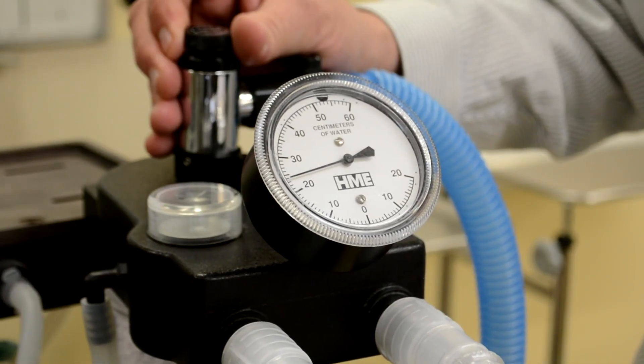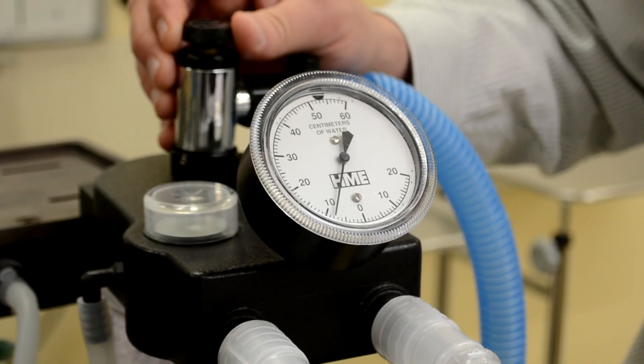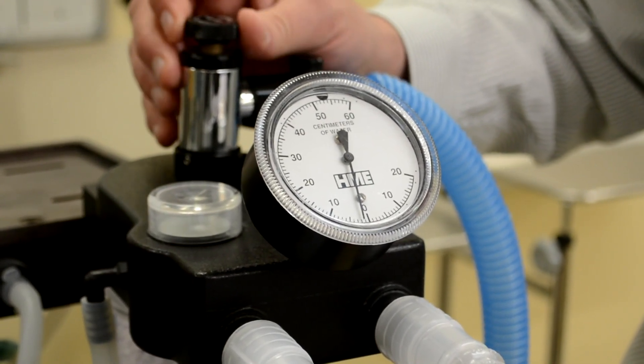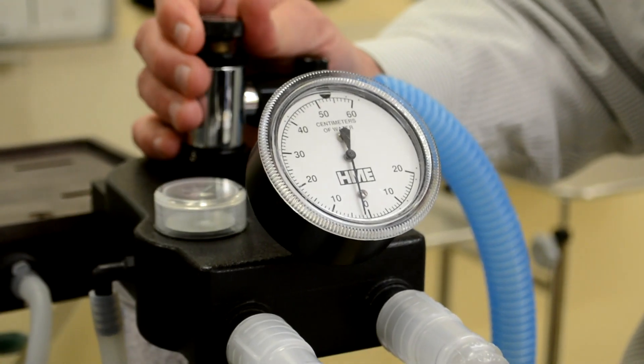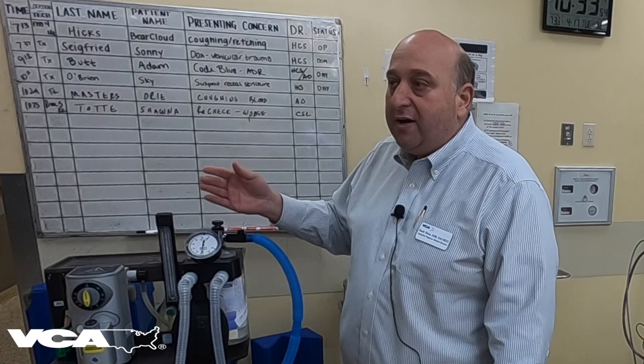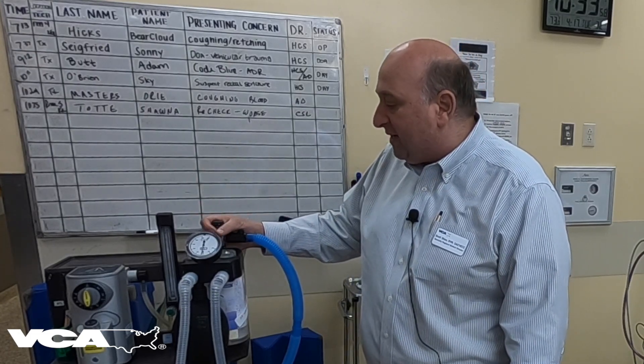Then what you want to do is slowly release the pop-off valve. You don't want to open it wide all at once and let the air rush out, because what can happen is that some of the barrel-lime can actually get sucked into your valves. It'll return all the way to zero, your pressure test is passed, and you're ready to go ahead and perform anesthesia.